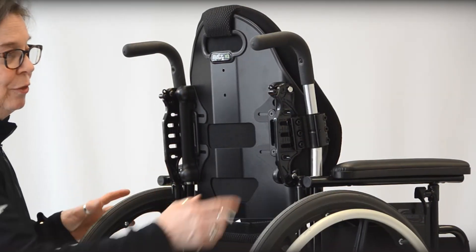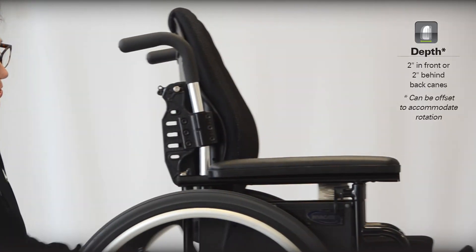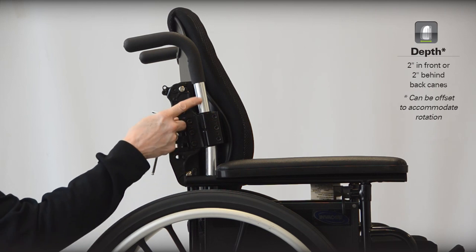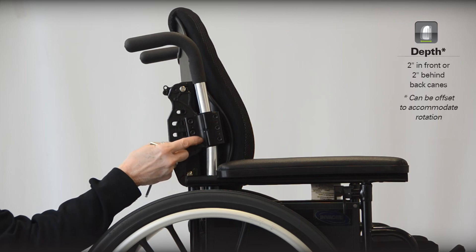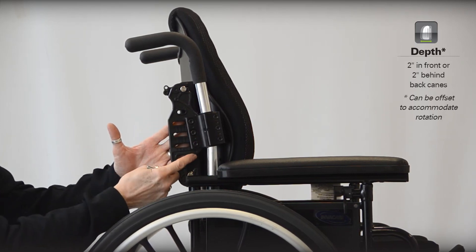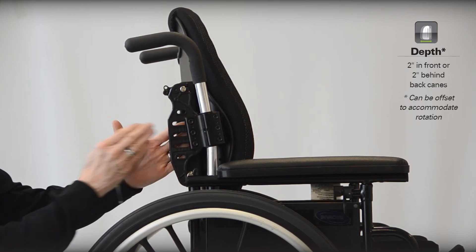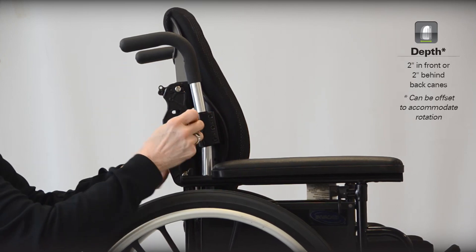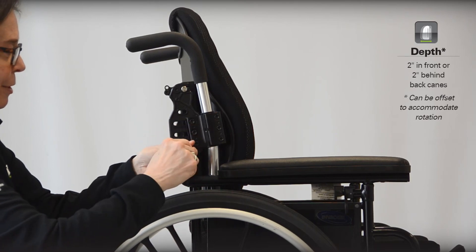Let's start with the EasySet hardware for depth and angle adjustment. Because this is a larger bracket, you can see where we have our clamp around the back cane. This is a larger bracket here, with three bolts that hold it on the cane. And then you'll see the three slots here and corresponding three bolts that we have to loosen to get our depth and angle adjustment. I'm going to loosen these on each side — I've set this up a little bit to be quick for you.